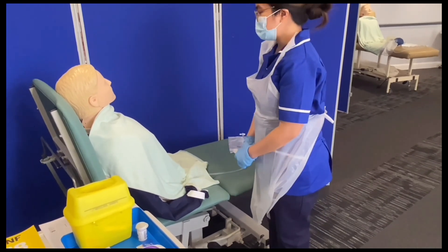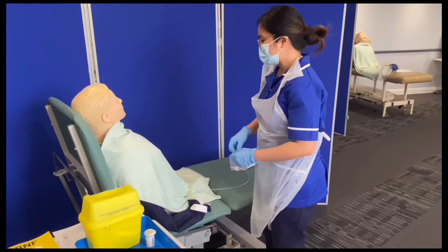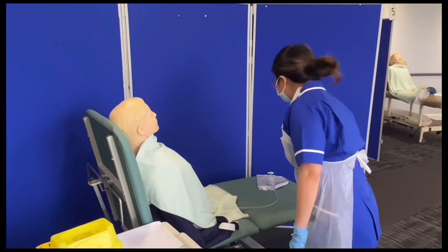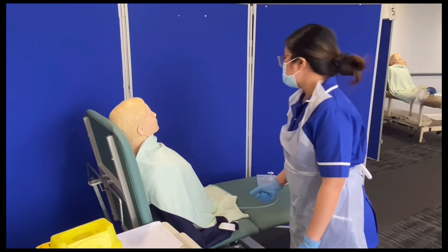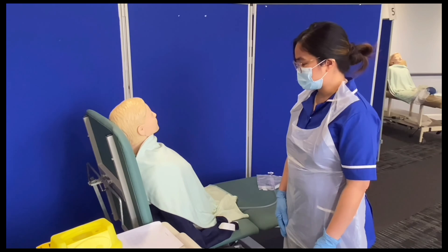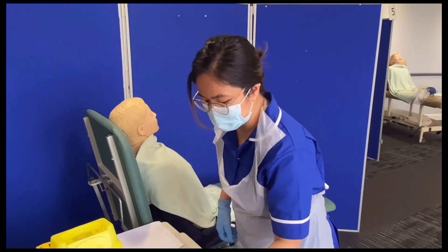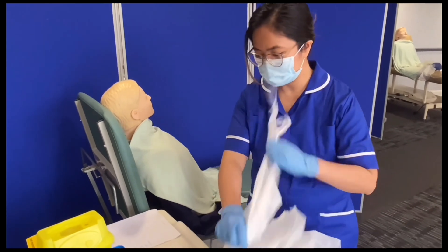Are you okay, Jennifer? I'm okay, thank you. I'm going to ensure that I record that in your records. I'm going to give you this call bell — you can press that if you've got any questions, okay? Right, I'm going to dispose of my equipment in the clinical waste bin.